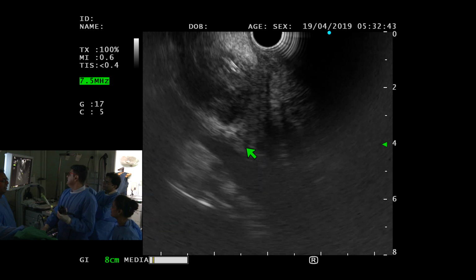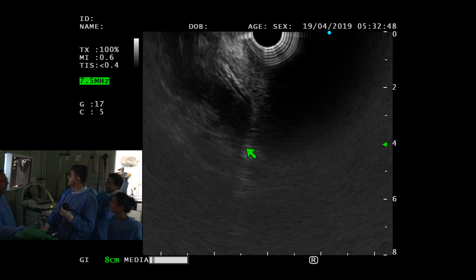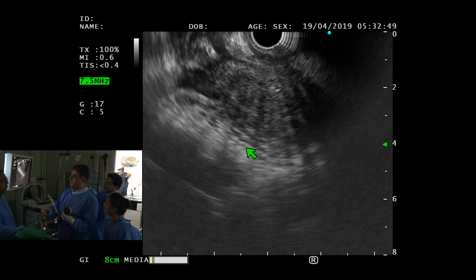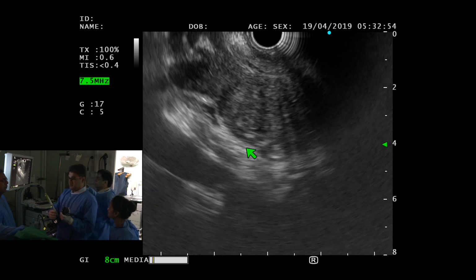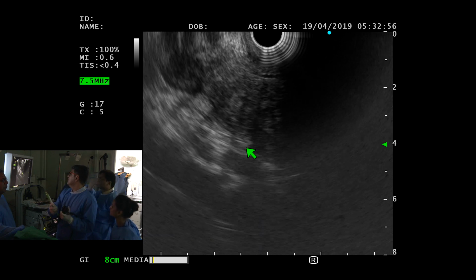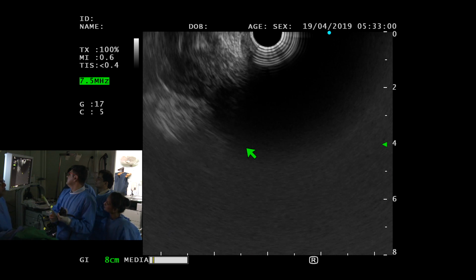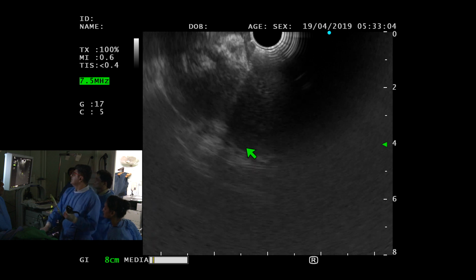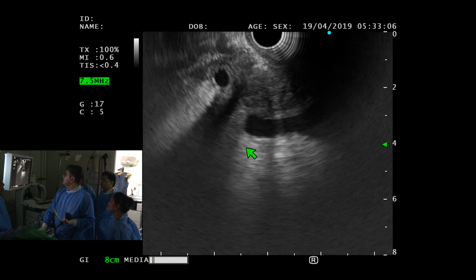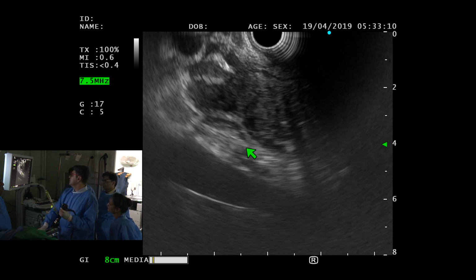Because I'm in the interim, you're really not getting the full picture of the needle for the sake of the trainees. You might just see some now as I managed to get it. It's ever so slightly difficult.